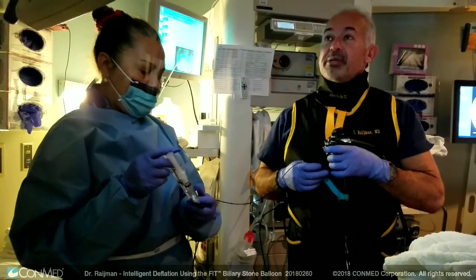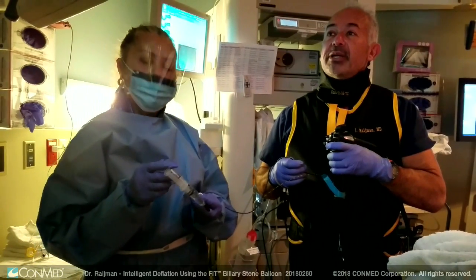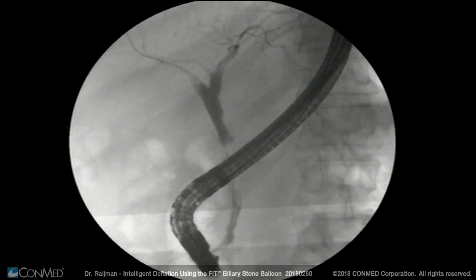So what I will do is unlock the balloon. As we unlock the balloon, I can gradually but persistently pull it back, covering the entire biliary tree without causing any type of trauma.